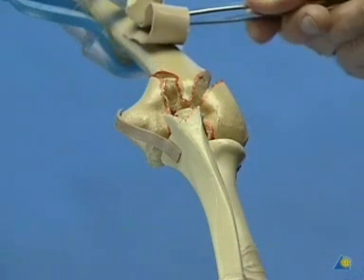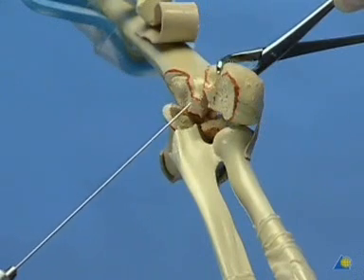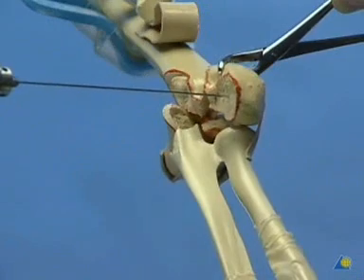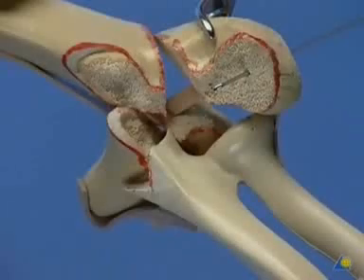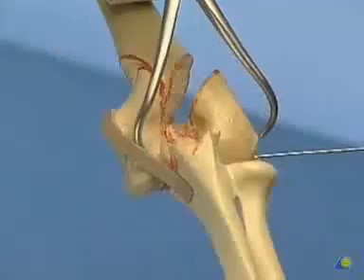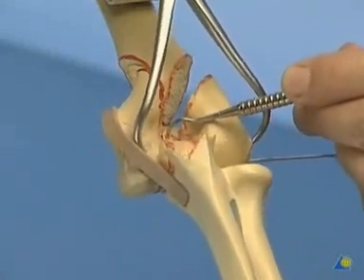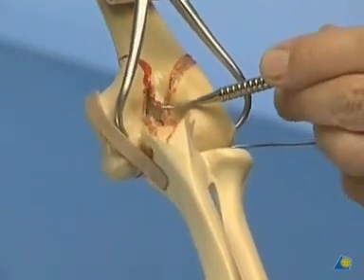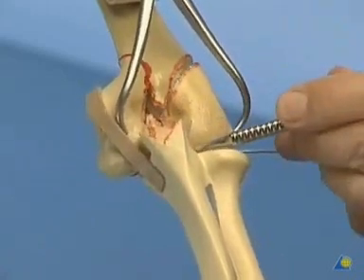In case of an intermediate fragment between the capitellum and trochlea, it is advisable to first drill a K-wire into the radial fragment by means of the inside-out technique. Therefore, the blunt end of the wire is sharpened by an oblique cut. A special 1.25 mm wire with threaded tip is selected because a cannulated 3.5 mm cancellous screw is to be used. The fracture is now anatomically reduced and held in place by a pointed reduction forceps, with care being taken not to damage the ulnar nerve.